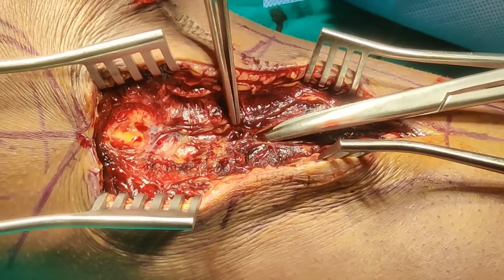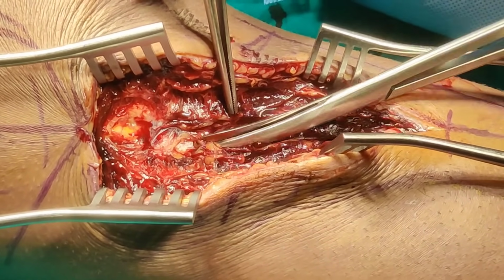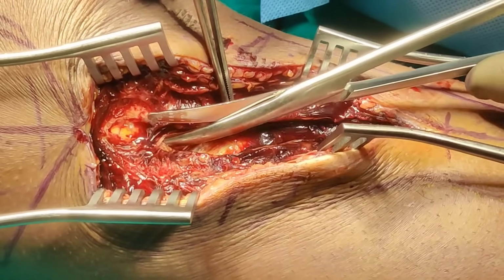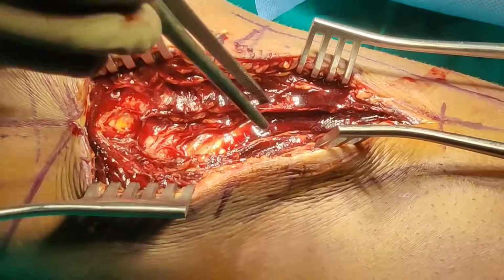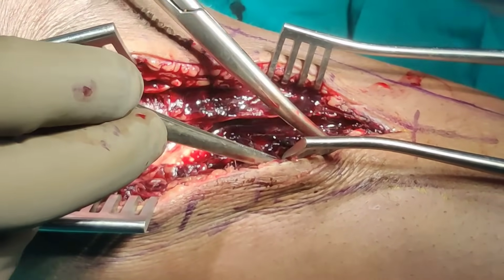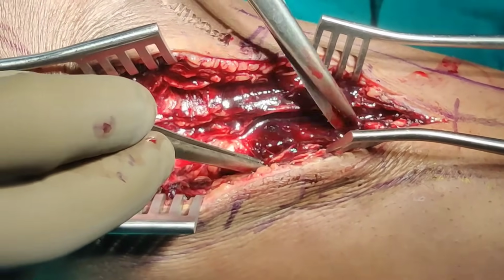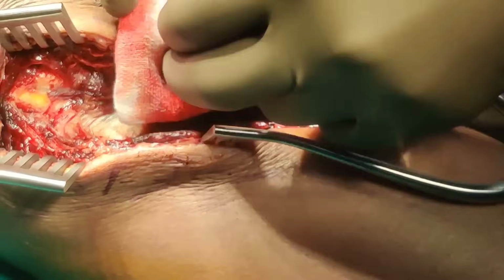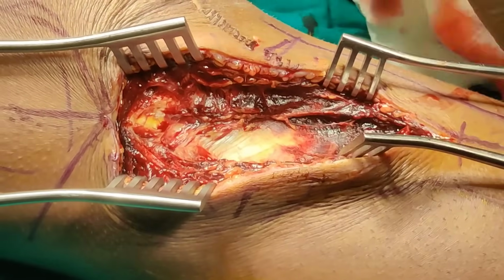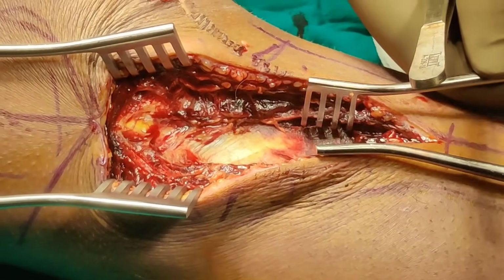So I'm just taking a knife. Now the first fascia that you find here is the crural fascia. So I'm just going to divide this both proximally as well as distally. Now in high energy injury, sometimes all these planes that you read are destroyed. But key is, even if you don't identify the plane, you keep on going, stay close to the bone.